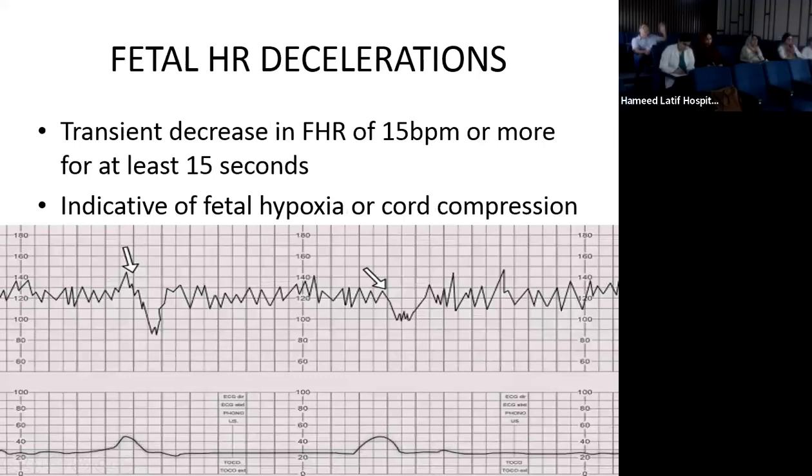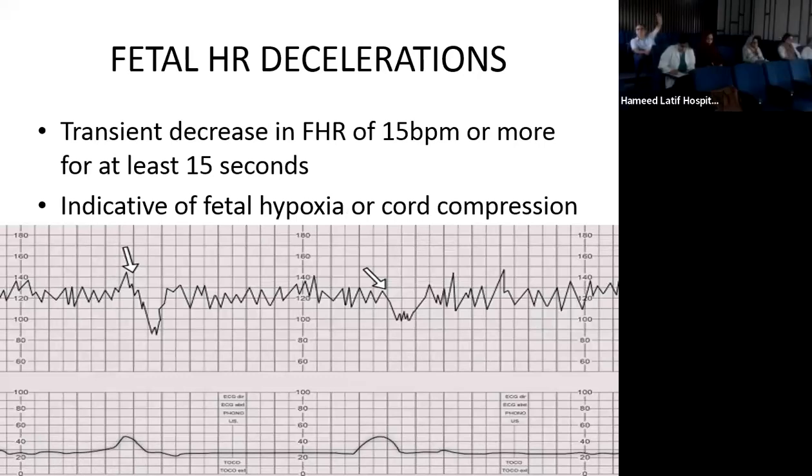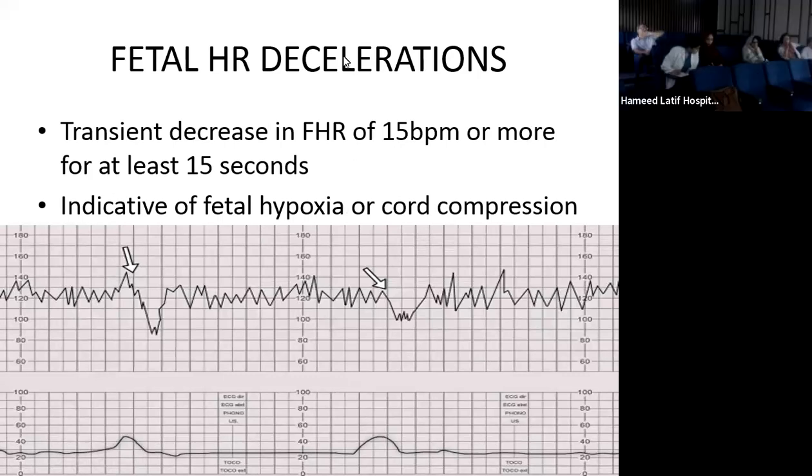What is a prolonged acceleration? Over 2 minutes, but less than 10 minutes. And if it is more than 10 minutes, what is it called?